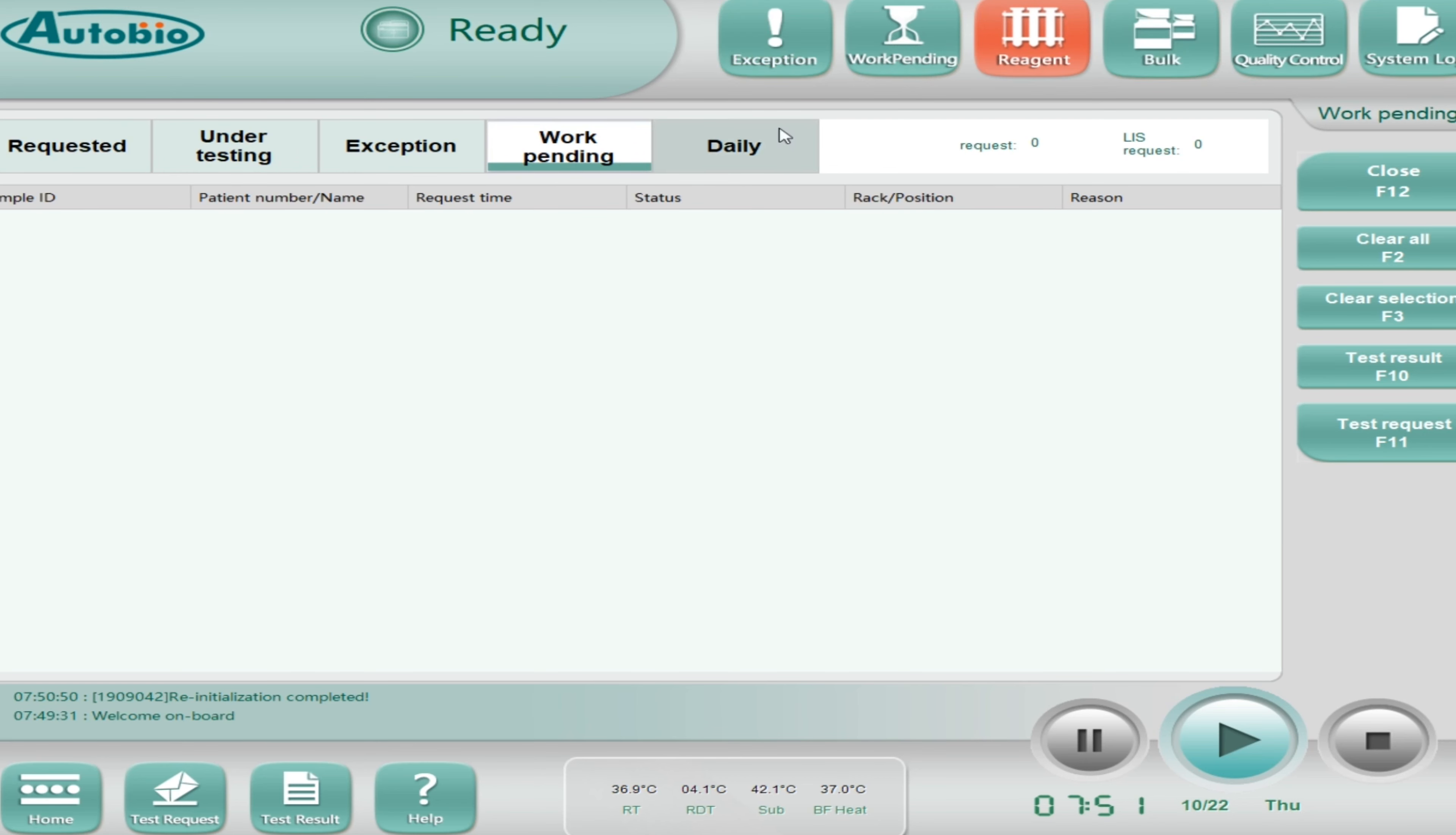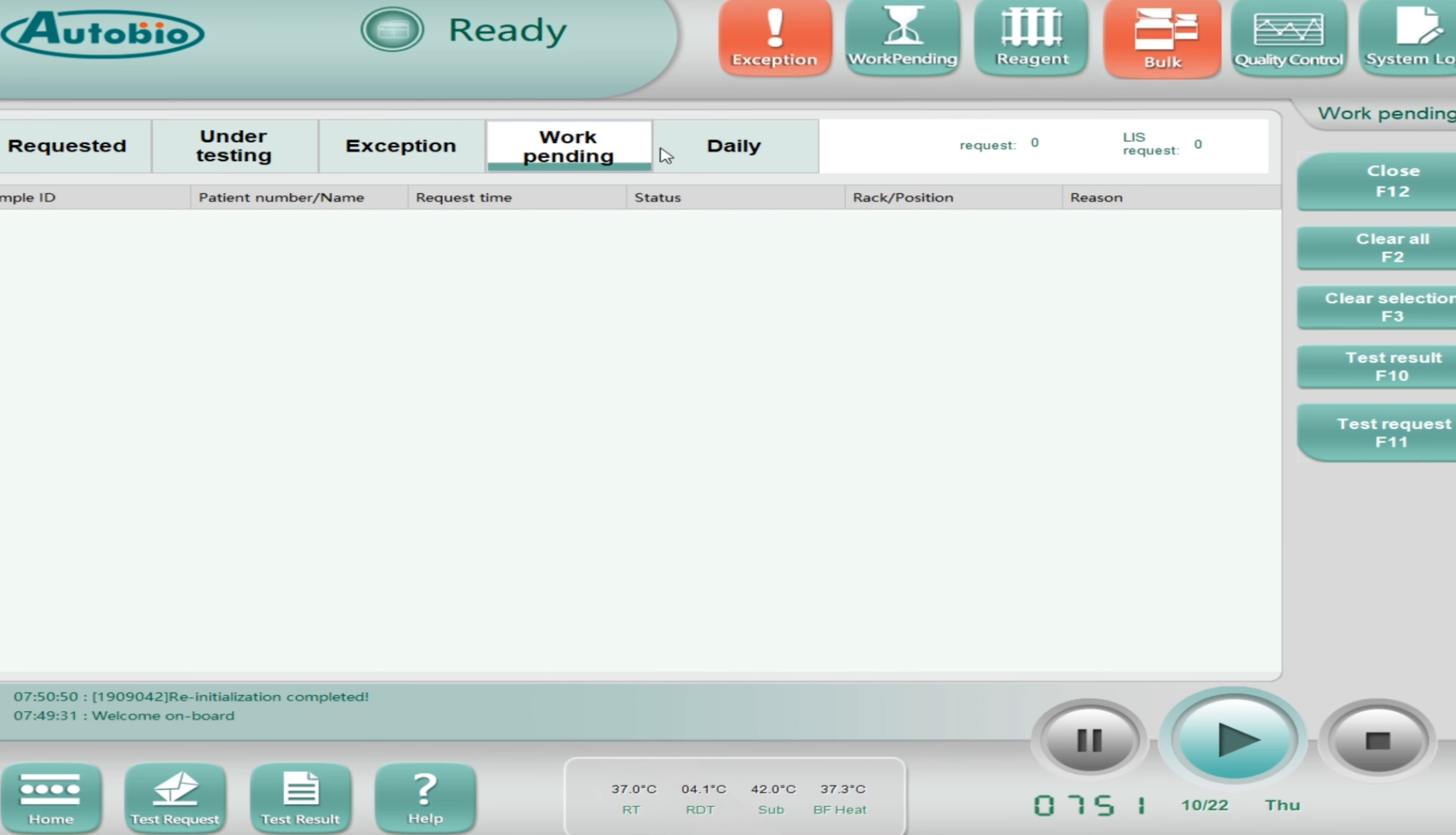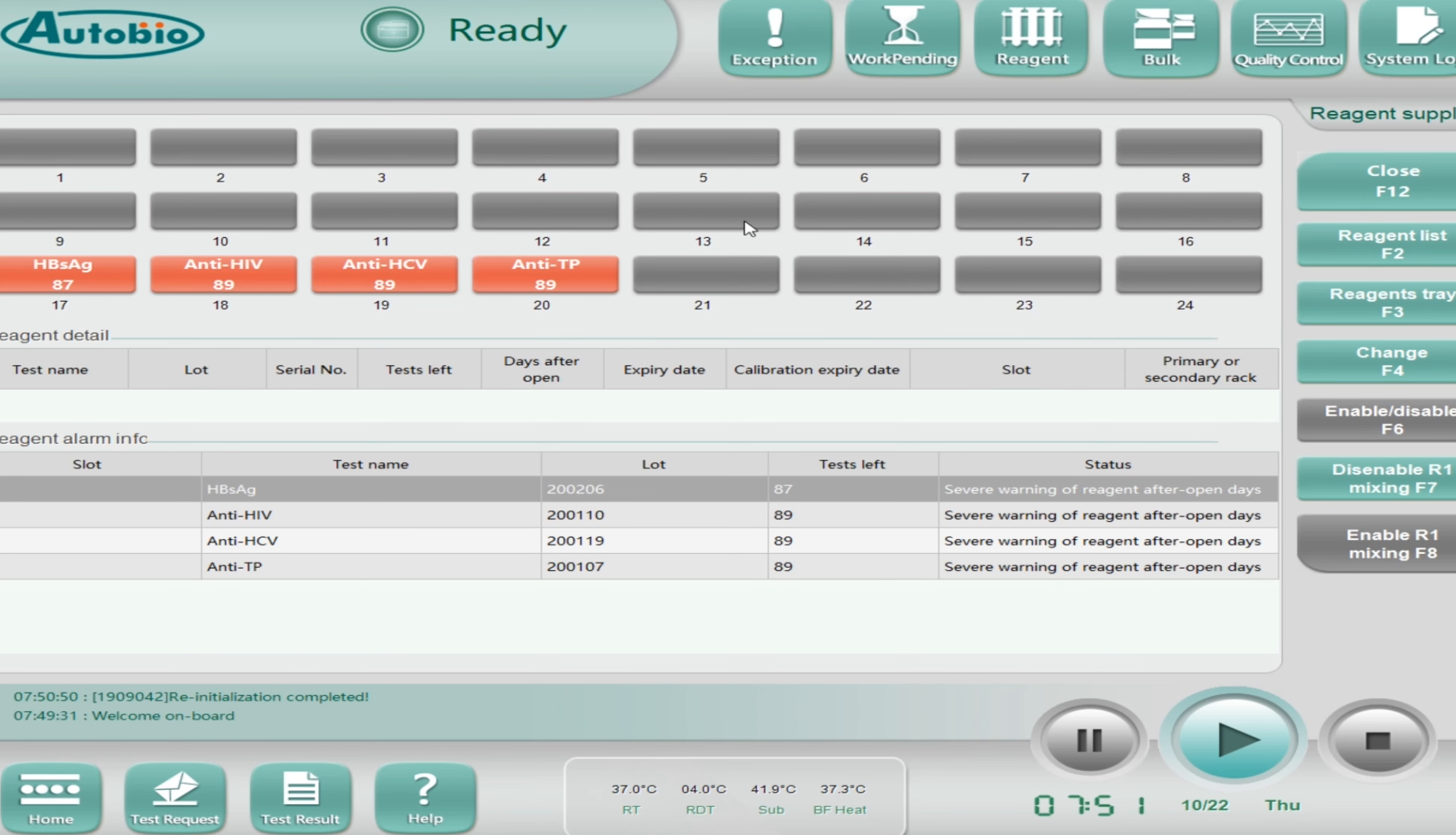To make it on ready mode, we have to click on the maintenance and then reset system and after that the initialization. Now it will home its all positions and then the status will be in ready mode. Now system is in ready mode.